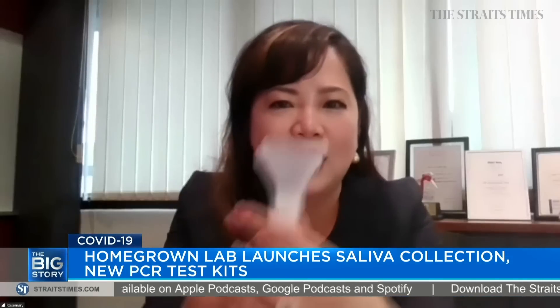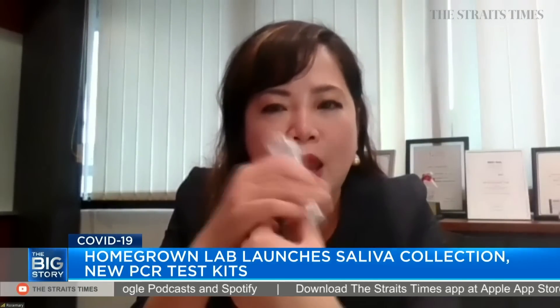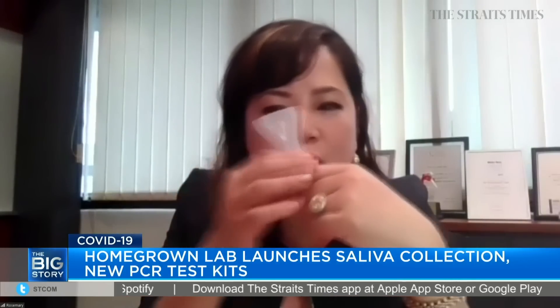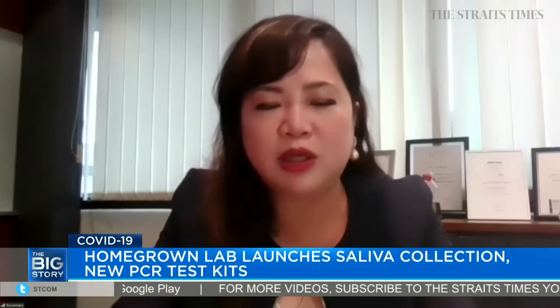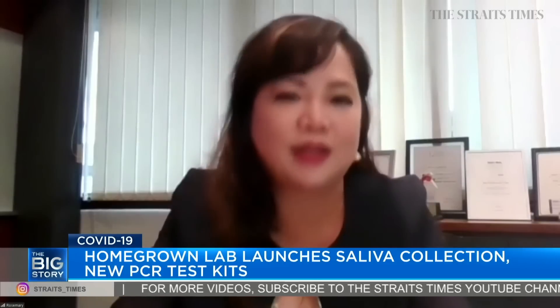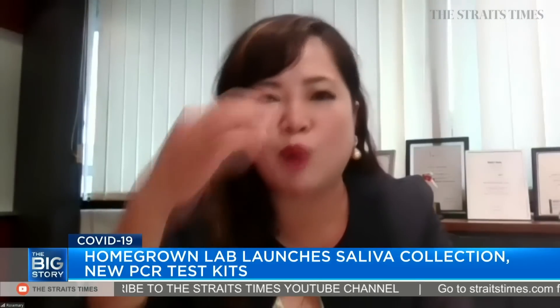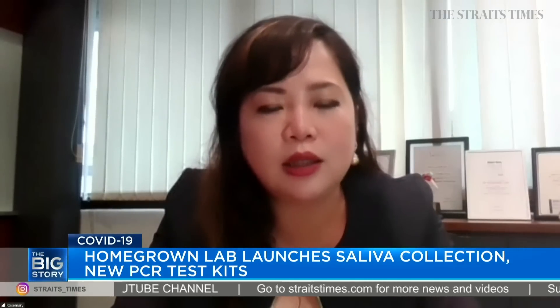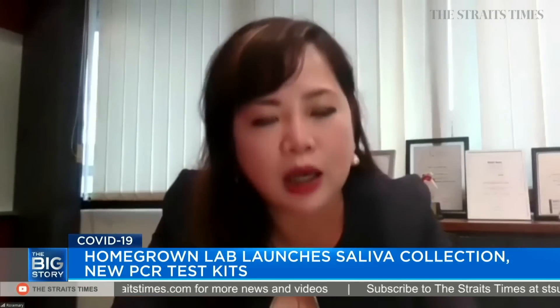The saliva test kit comes in a collection tube. It's very simple — all you need is to spit in enough saliva, and then it's kept sealed. We have a biohazard bag to place it in for you to send it to the labs or testing sites for PCR detection. So it can be used in any location, because basically you just need a tube to collect it. You do not need a swabber or to queue up to get a test done by the swabbing method. Whether or not it can be used in any location — I think it's really up to our imagination. Anywhere that you need to have a test done accurately, reliably, and easily, that could be a possible solution.